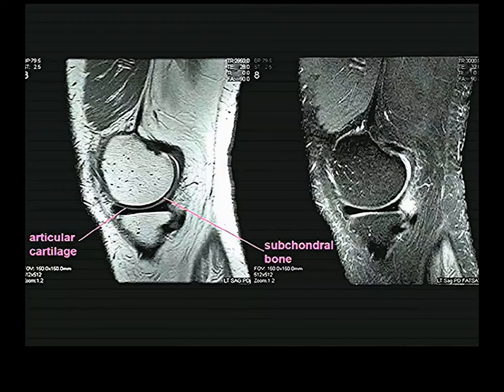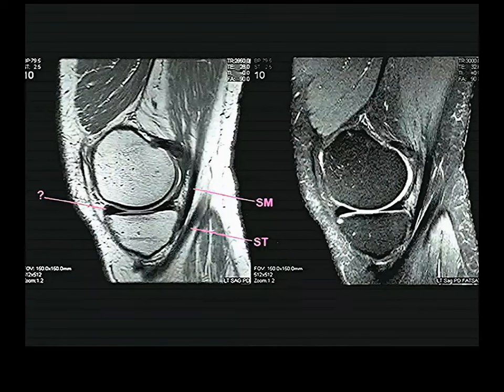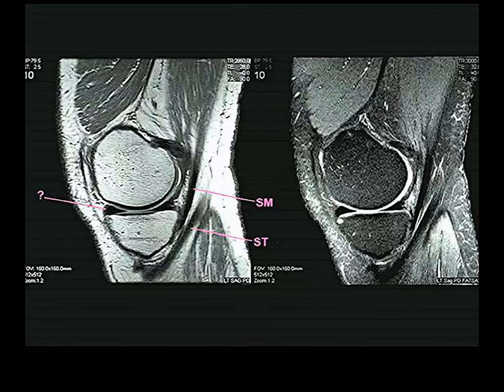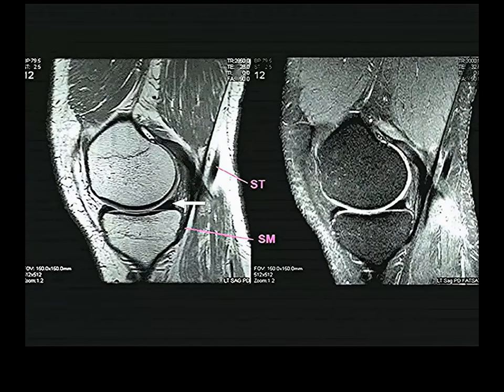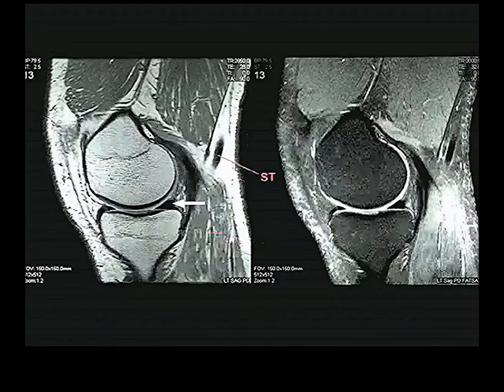Going further medially, we see the medial meniscus — specifically the anterior arm and the posterior arm on the posterior side of the joint. The meniscus appears as a dark triangular structure, which makes sense since it's fibrocartilage.